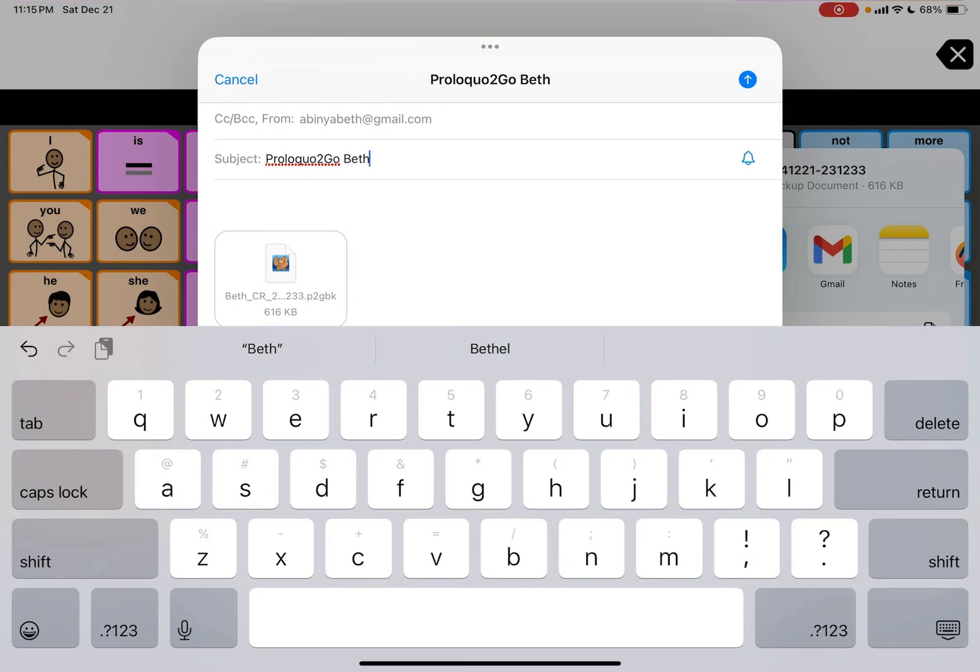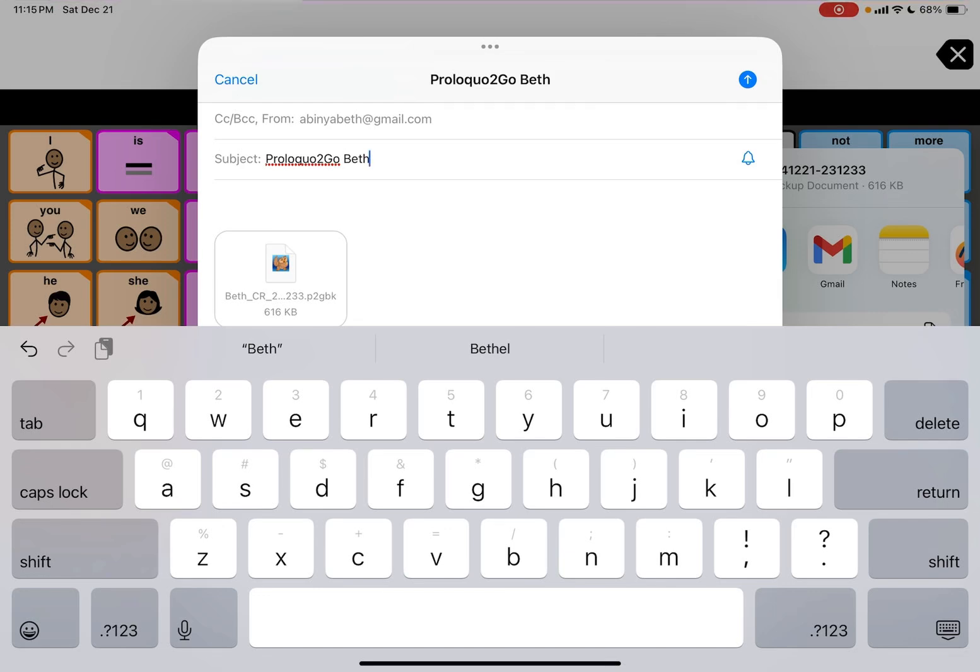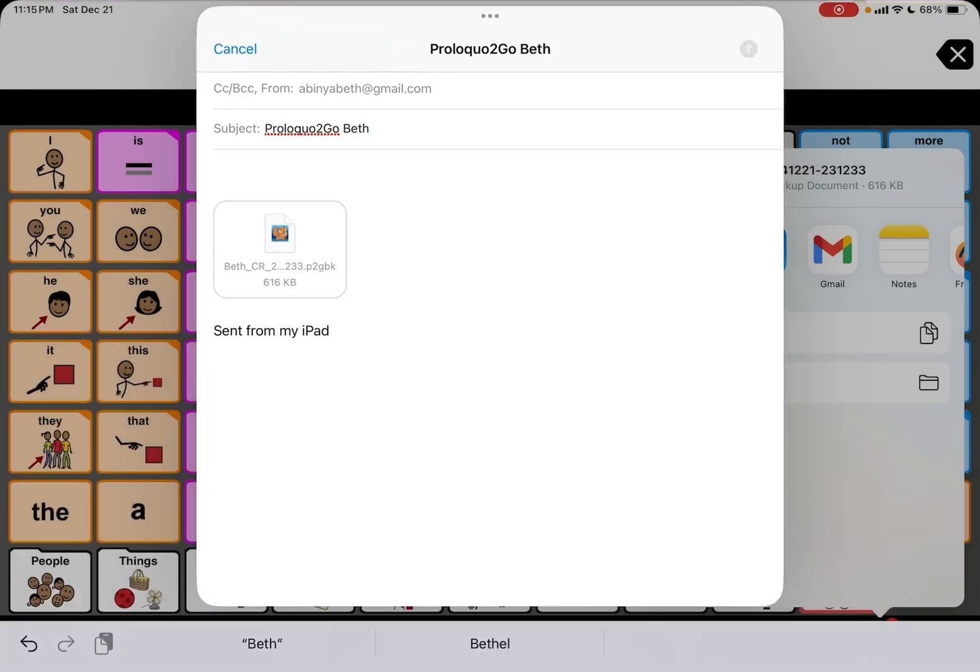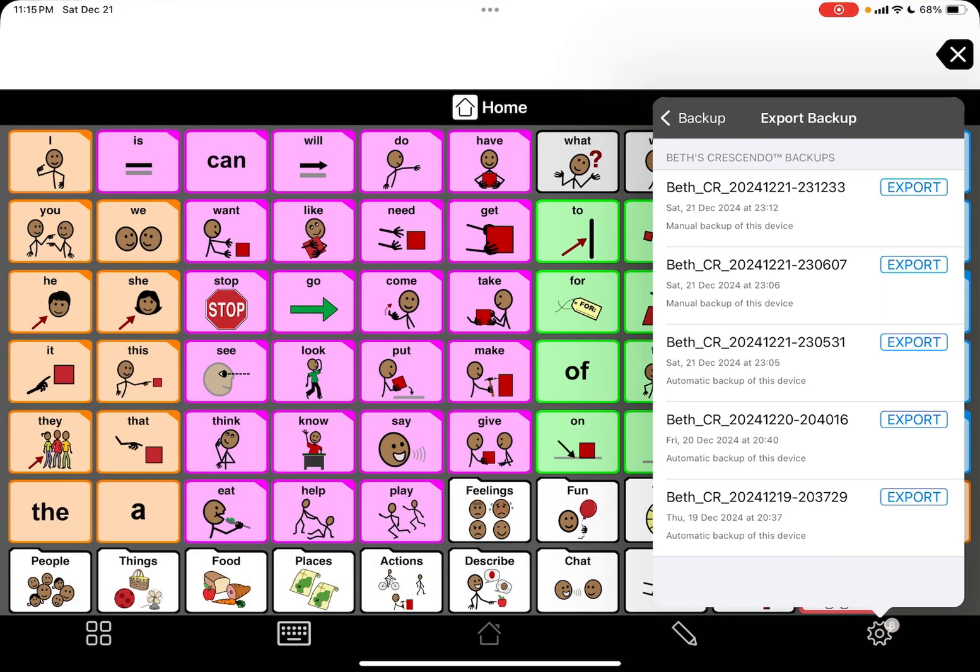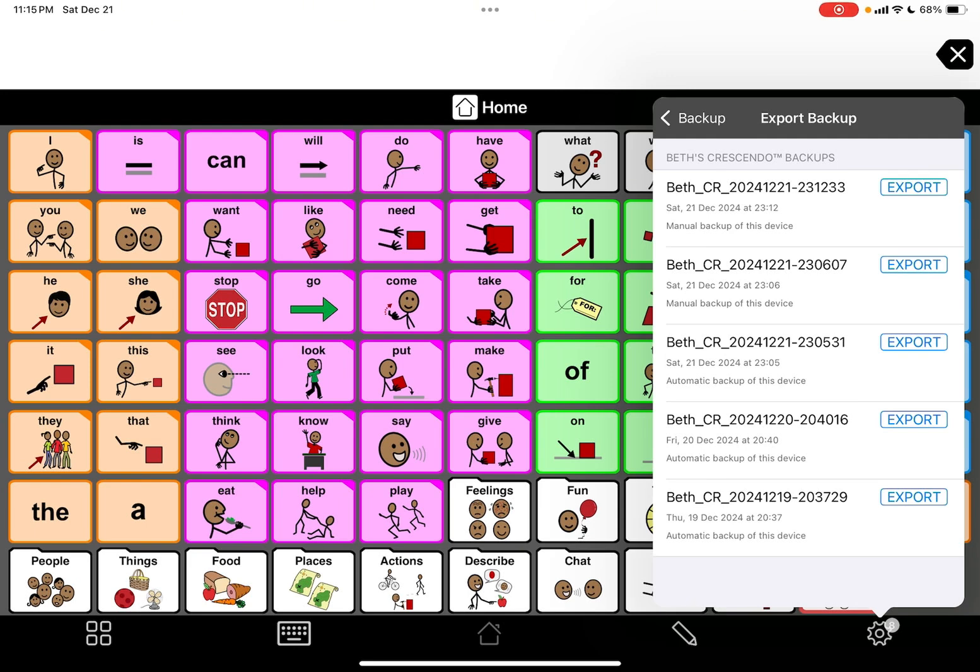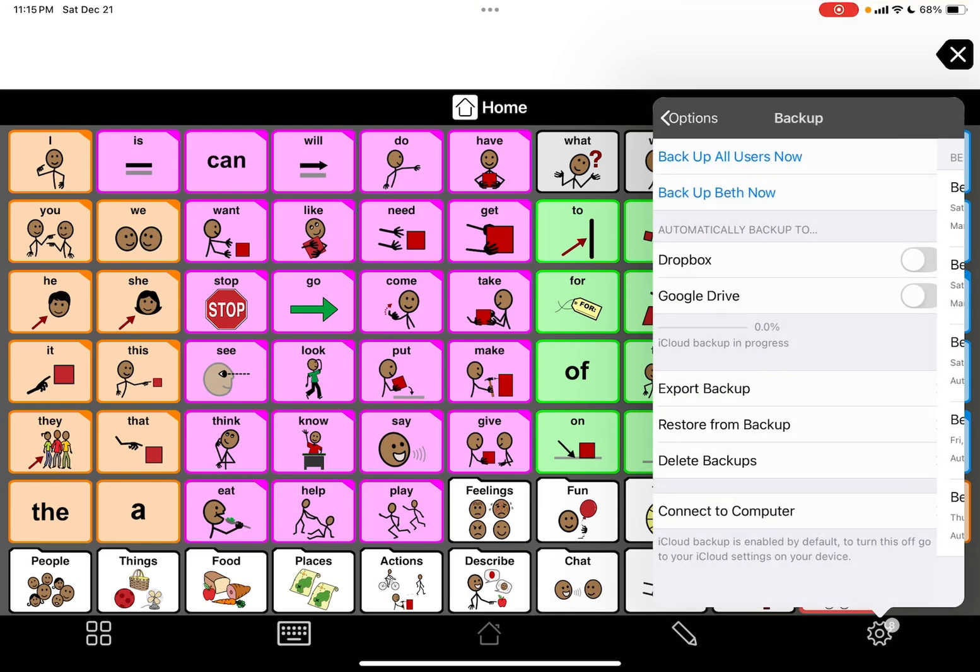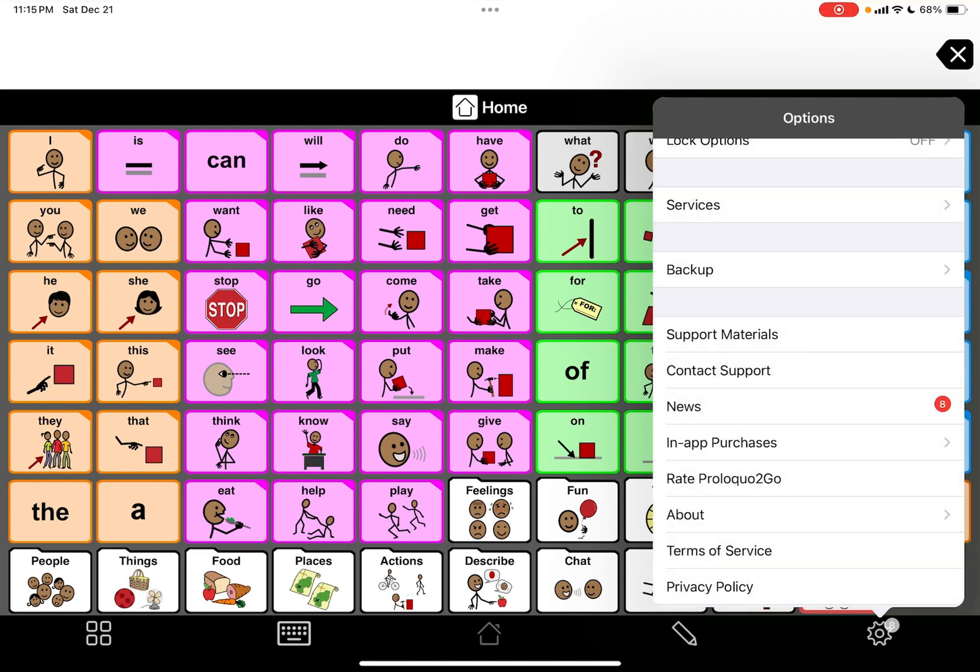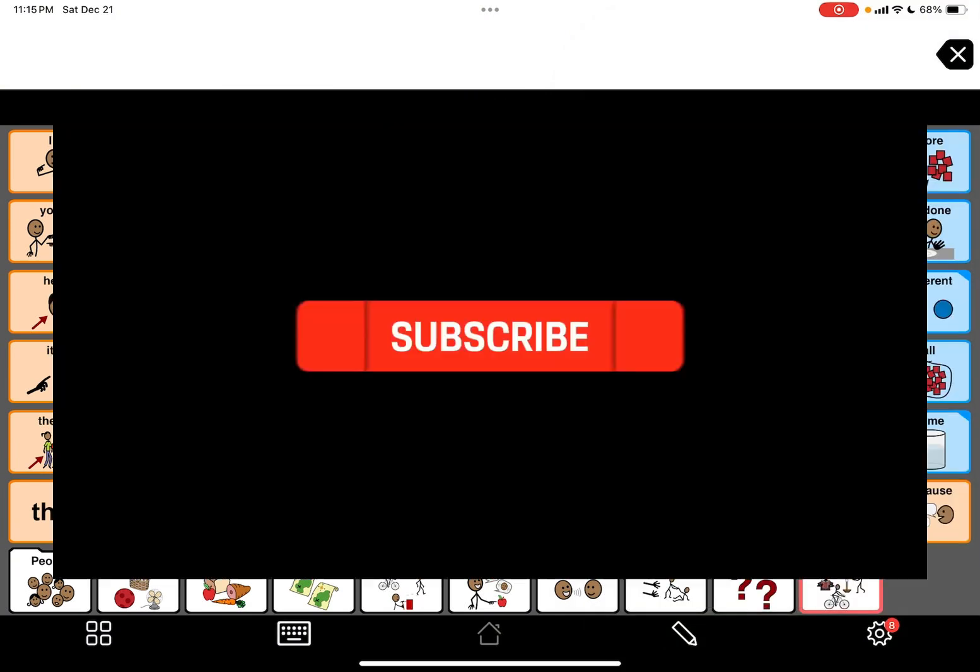If they open it up somewhere else on a computer or wherever, it's not going to look like Proloquo. You can't essentially really access it. I just wanted to let you know that. So here we go, I'm just going to email it to myself and then now I have a copy there as well. I hope that was helpful.